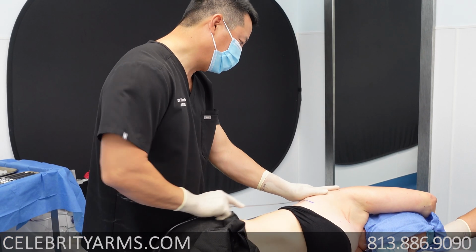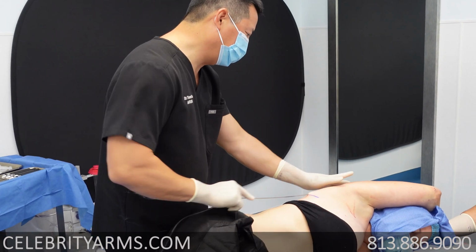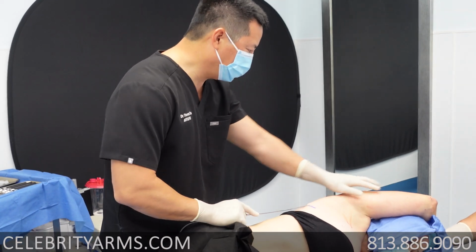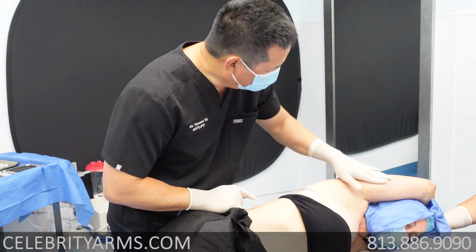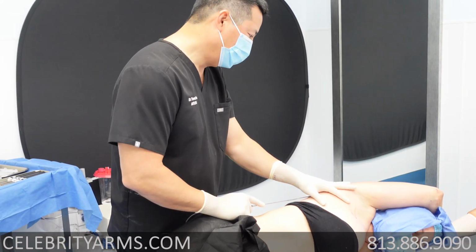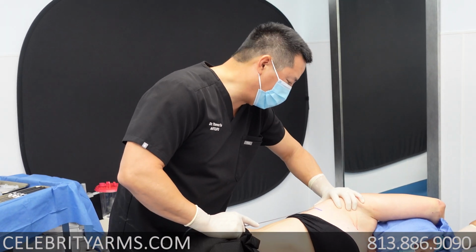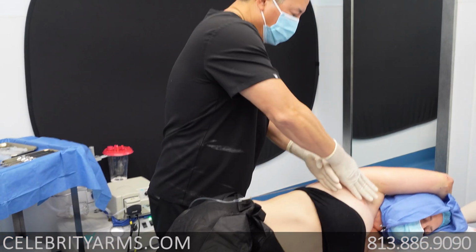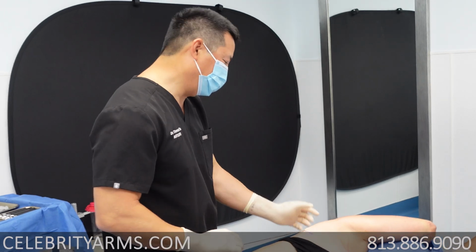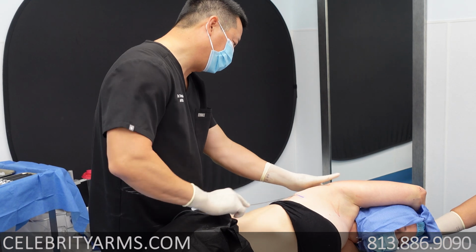Okay, so this is just another one of those positions that we use. We use a lot of different positions because when you're going all the way around the arm, it's a lot different than just working this area. This little area is all that other doctors do, right here, this lower edge of the arm. Right now what we're doing is we're going into the upper back. So we do this upper back area, which is everything above the bra line, and we extend up into the armpit too, because the fat in this area does make a big difference for a lot of patients.